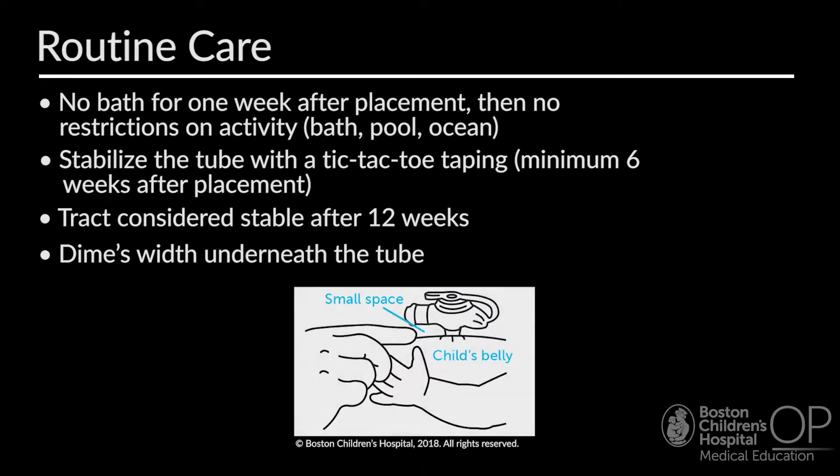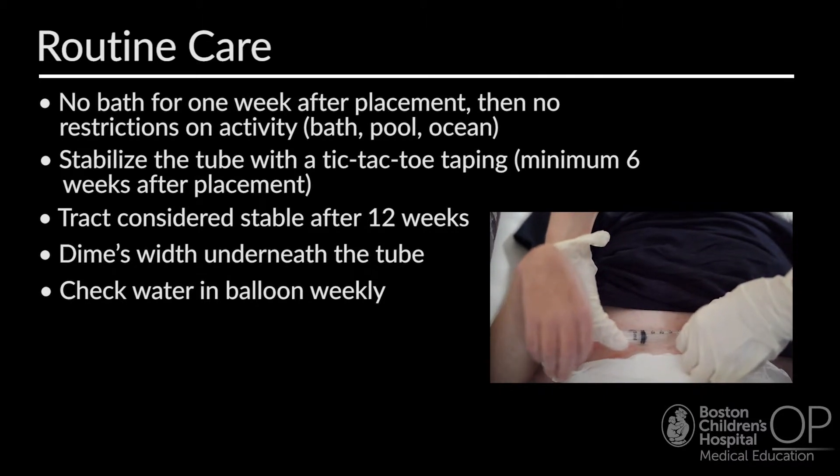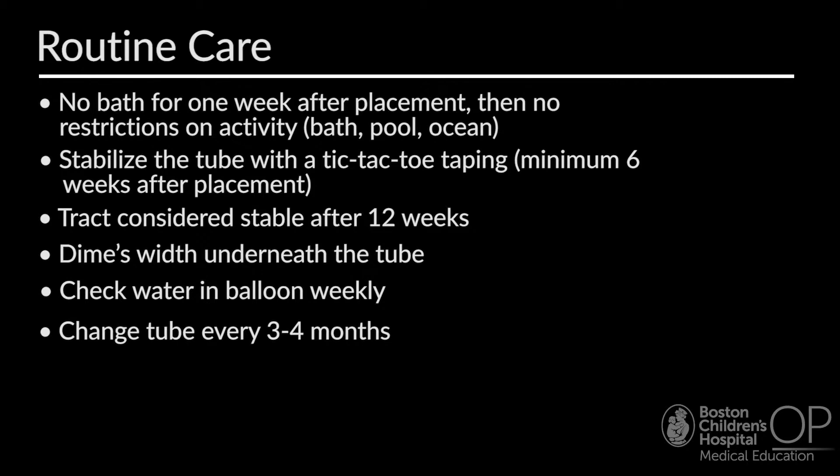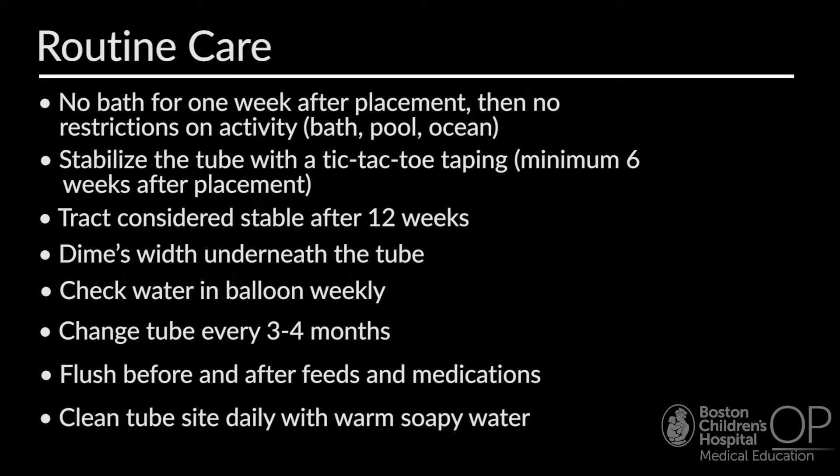You should be able to rotate the tube with a dime's width underneath. Children may need their tube upsized over time as the child grows. Caregivers should check the volume of water in the balloon weekly. The G-tube is typically changed every three to four months, or sooner if fluid is leaking from the middle of the G-tube — which may mean the one-way valve is worn down — or if water is missing from the balloon after two weekly checks. Caregivers should flush the tube before and after feeds and medications to prevent clogging, and clean it daily with warm soapy water. Extension tubing can be removed when possible so it doesn't get caught on clothing or other objects.